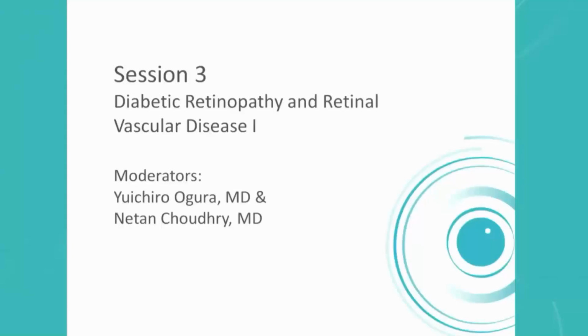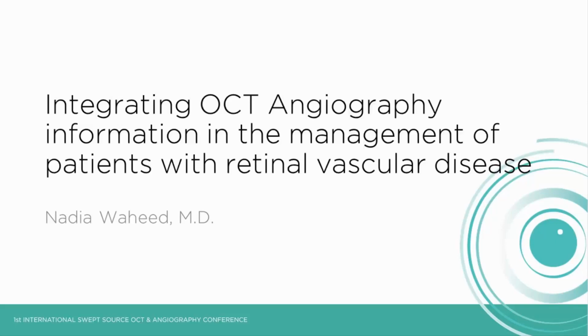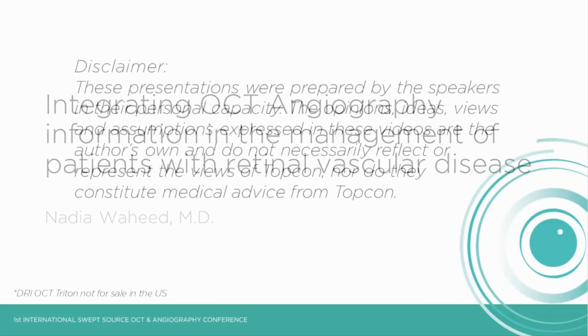Our next speaker will be Dr. Nadia Waheed from Boston, discussing integrating OCT angiography information in the management of patients with retinal vascular disease.